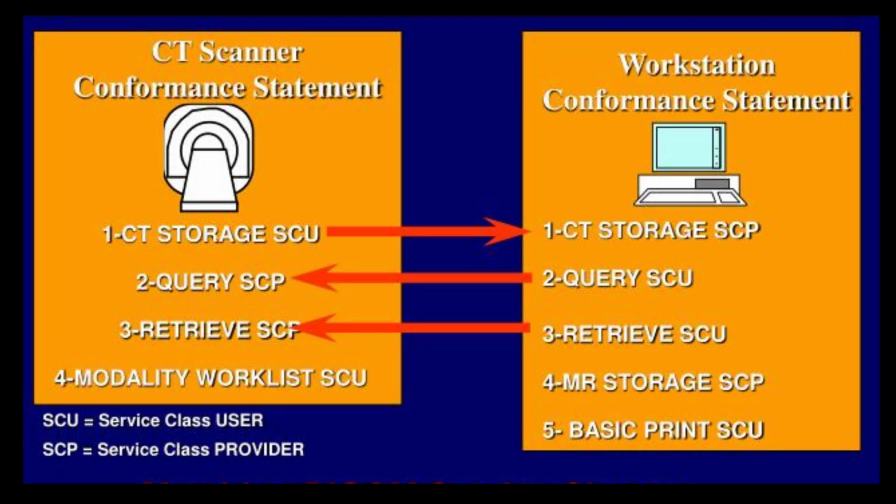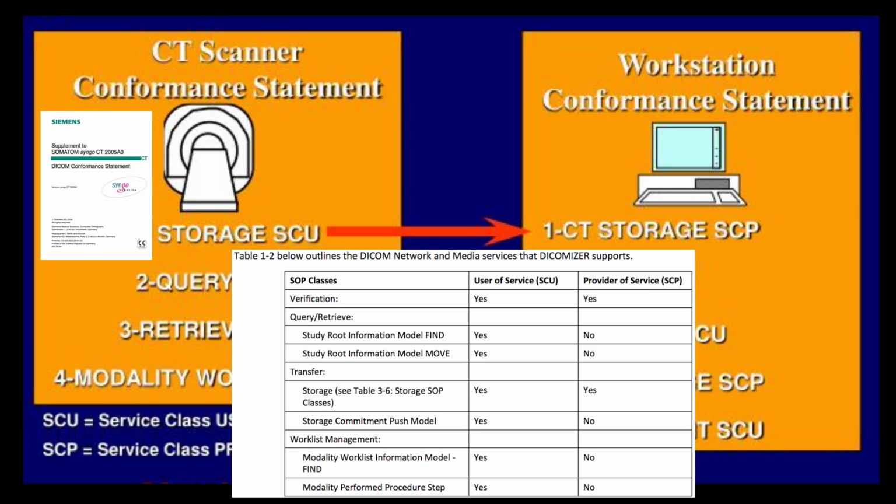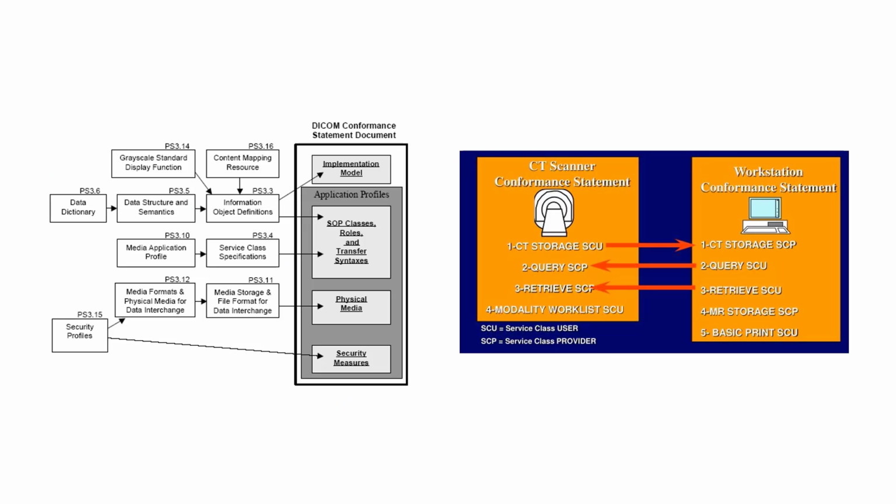Conformance statements allow you to check the service class user and service class provider. Here we can compare the scanner and workstation by using the DICOM conformance statement document.